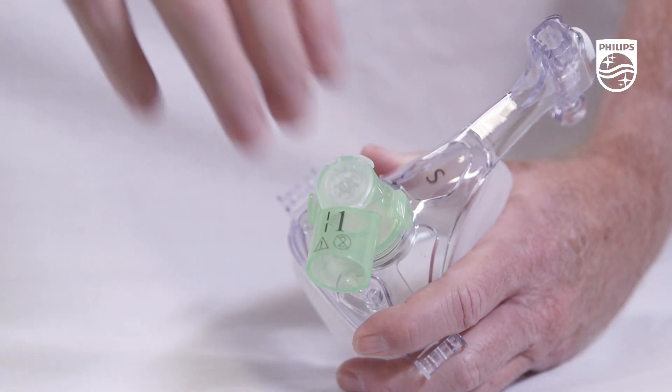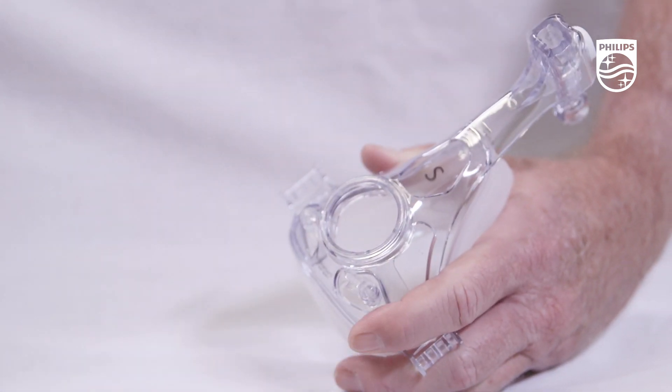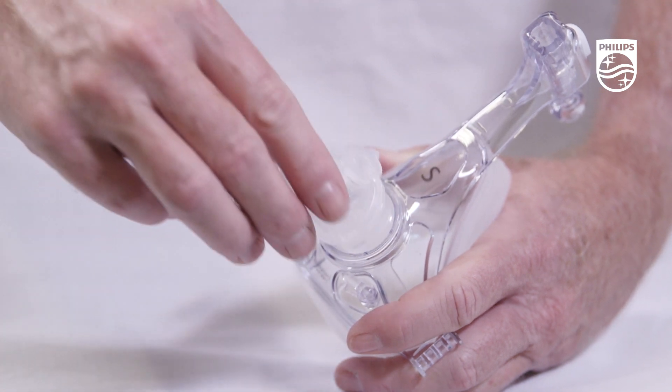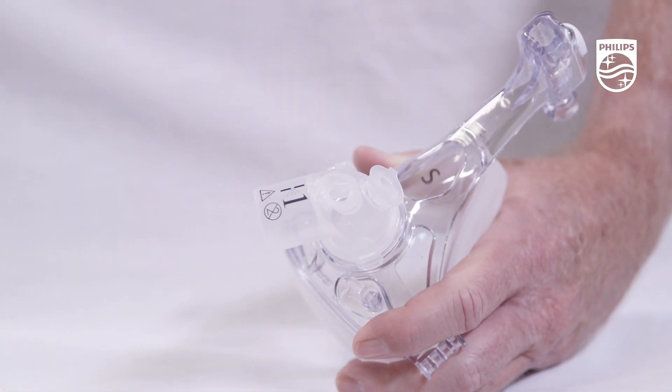Elbows may be removed by pressing the retention clips on either side of the elbow. Elbows may be attached to the mask frame by pressing straight into the opening on the front of the frame until an audible click is heard, which indicates that the retention clip is engaged.